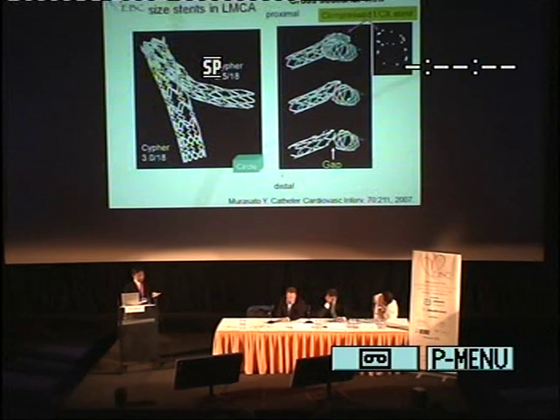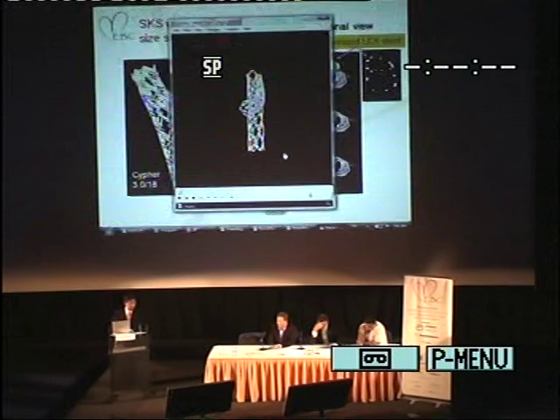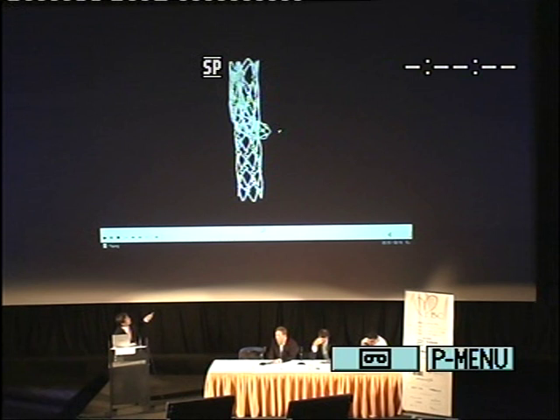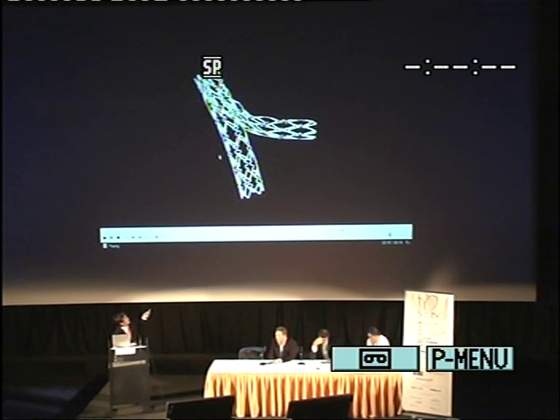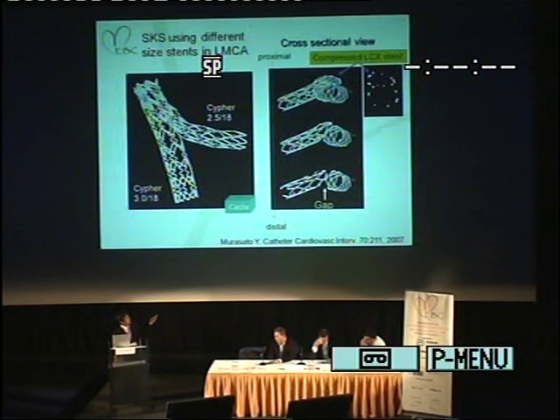We investigated the stent condition after SKS using a three-dimensional phantom model. These are the micro-focusing images of SKS using different-size stents in the LMCA. You can see a 3.0 Cypher stent and a 2.5 Cypher stent. The LCX stent crosses over the LAD, and there is a small gap just beneath the crossing point. In the cross-sectional view, the LCX stent crosses over, and in the proximal LMCA it is compressed by the LAD stent.